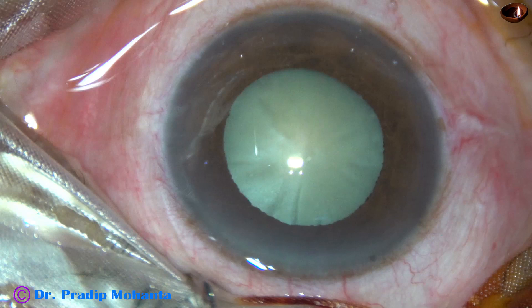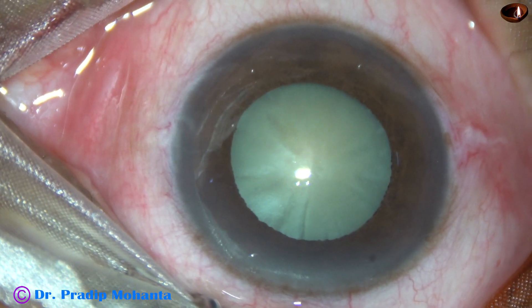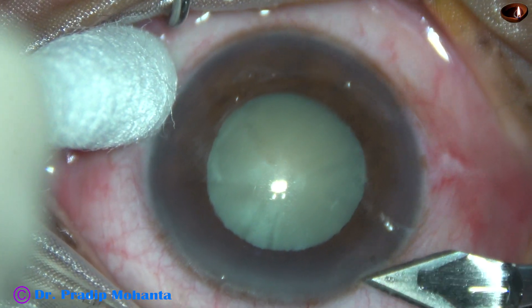Friends, let us observe unedited phaco of this white cataract. Does it look like an intumescent cataract? Probably yes, but it is not yet intumescent. Let us observe the surgery.